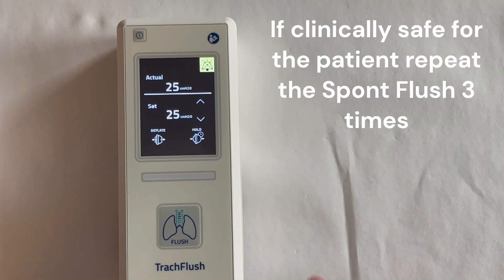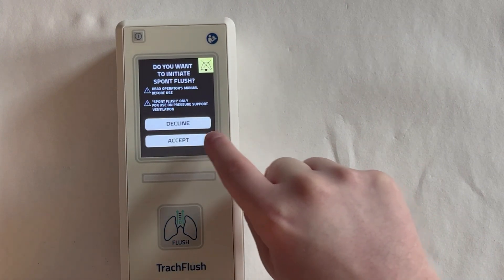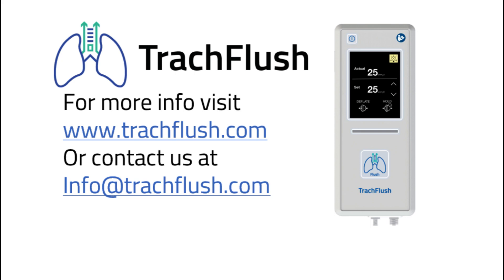It is recommended, if it is clinically safe for the patient, to repeat the Spont Flush at least 3 times. For more information visit trachflush.com or contact us at info@trachflush.com.